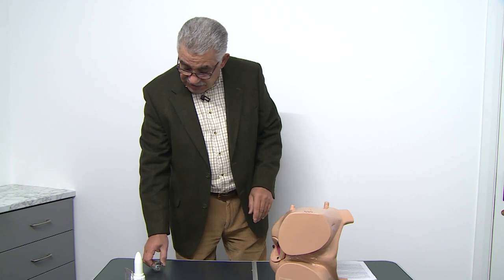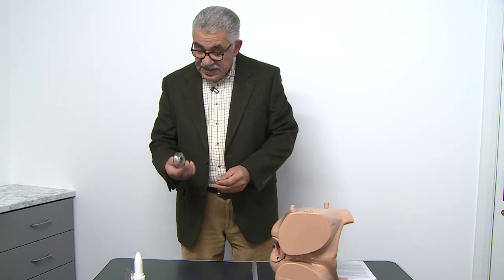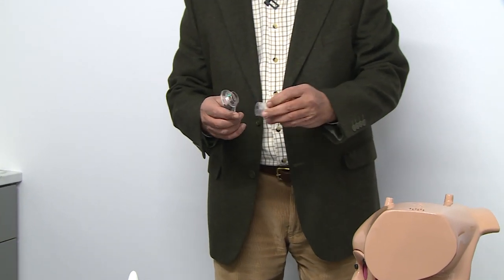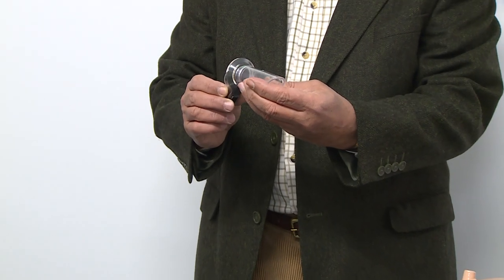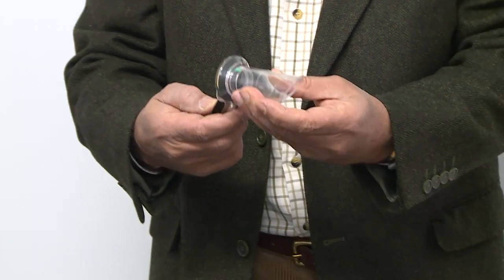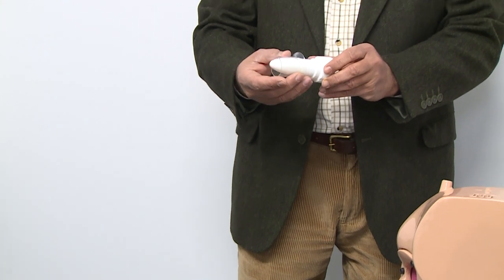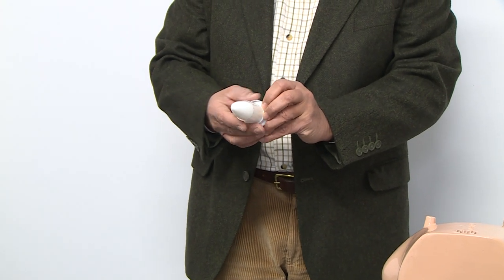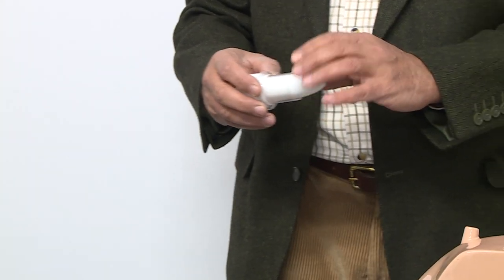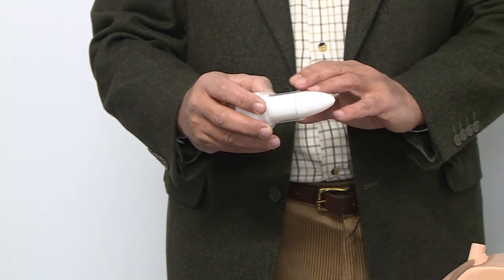The first step is to assemble the scope. The handle comes with the light module and we connect the handle into the main body of the scope. It contains the light. Then we have the trocar and the sleeve, and we introduce the trocar into the sleeve to begin the procedure.